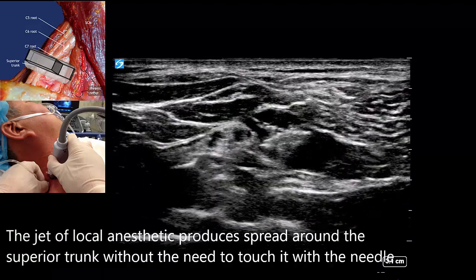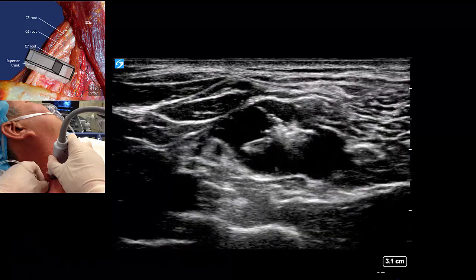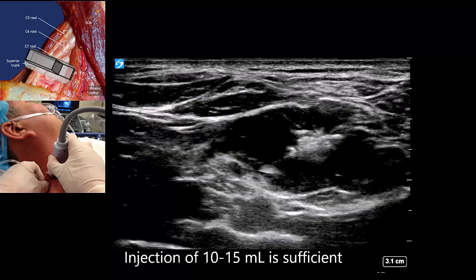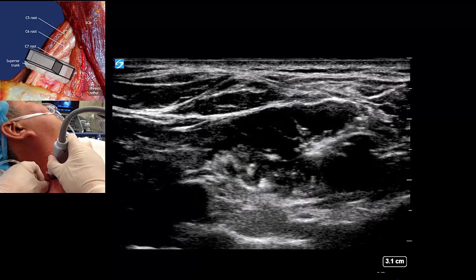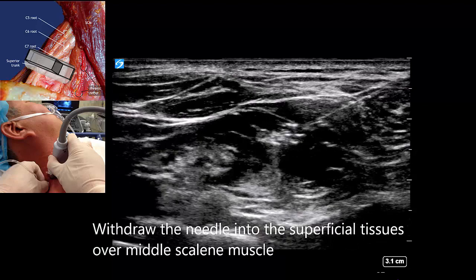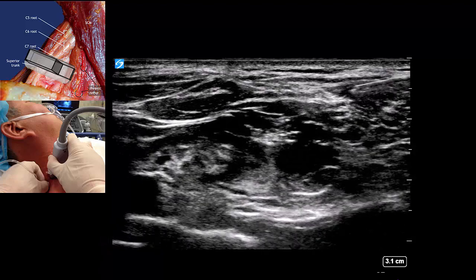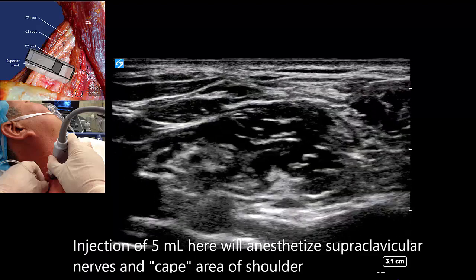Minimize needle-nerve contact as much as possible. Ten to fifteen milliliters of local anesthetic is sufficient for clinical anesthesia or analgesia. The supraclavicular nerves that innervate the skin over the cape of the shoulder can be easily anesthetized by injecting five milliliters of local anesthetic into the superficial tissues over the middle scalene muscle.